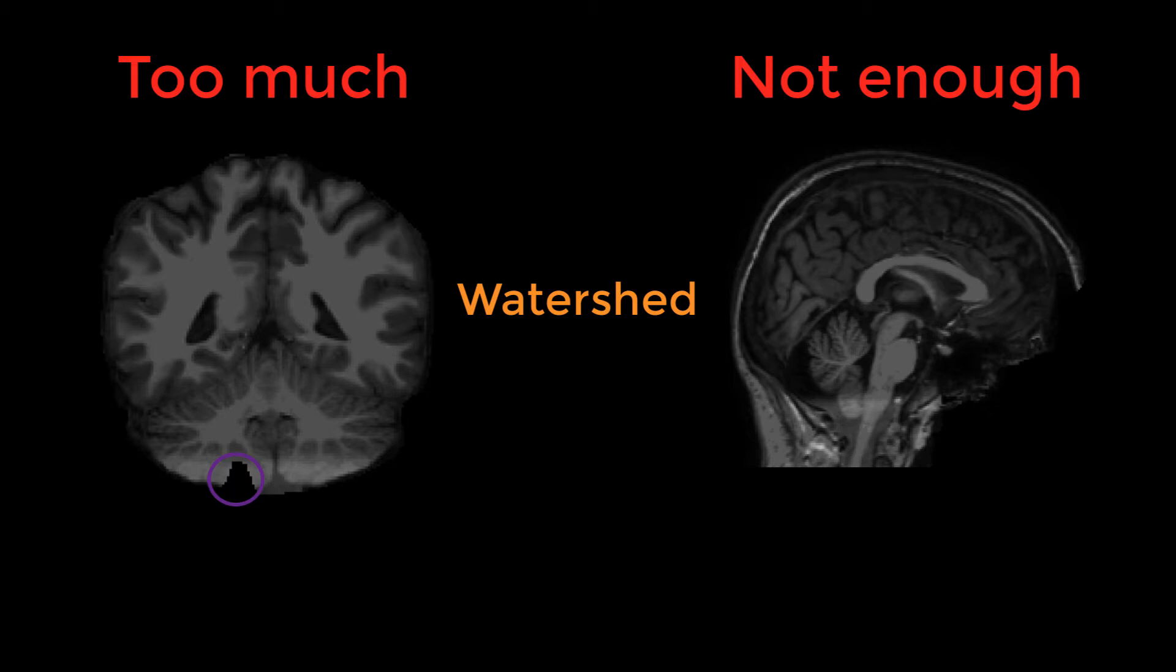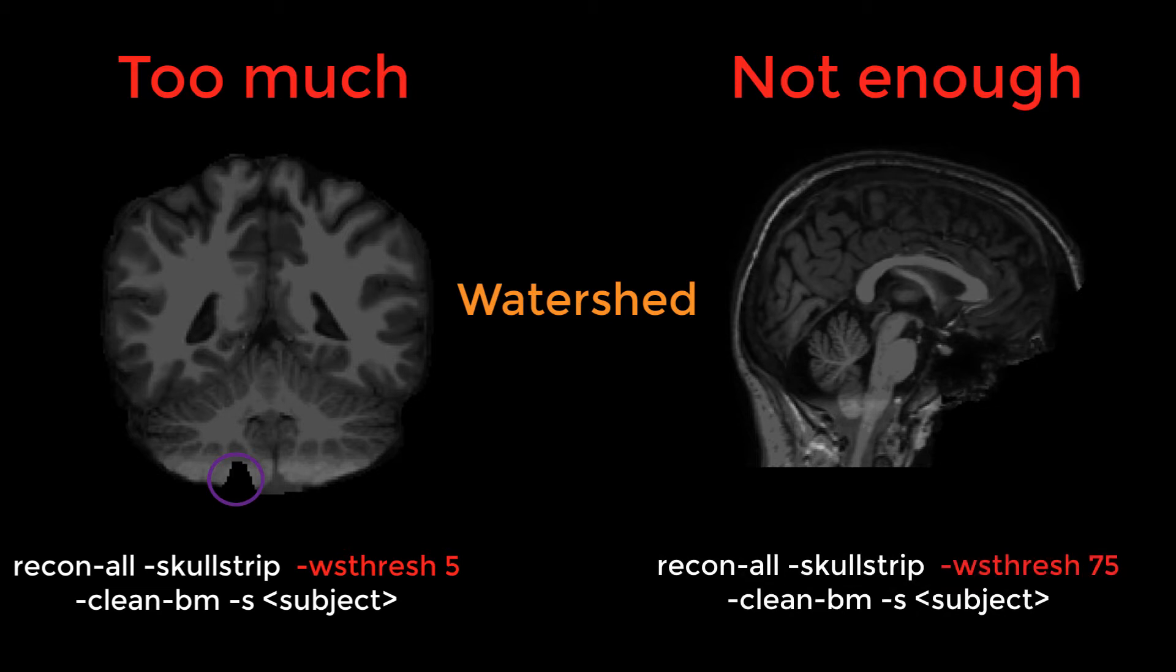Lower values for the WS Thresh option in Recon All will remove more skull, while higher values remove less skull.